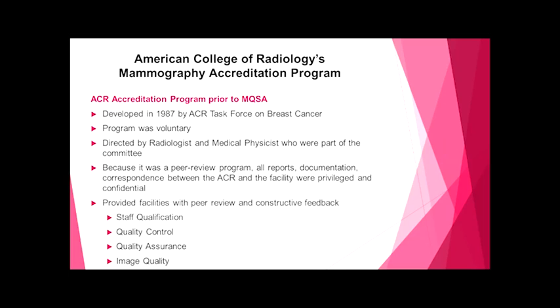This was to be a program, yes, to address all of the quality parameters, but also a peer review program. And in their wisdom in the beginning, because it was a peer review program, all the reports, the documentation, the correspondence between the ACR and those facilities that chose to participate was privileged and confidential. And here's one of the components that is in MQSA, but sometimes I don't think that we always refer back to it as we should.